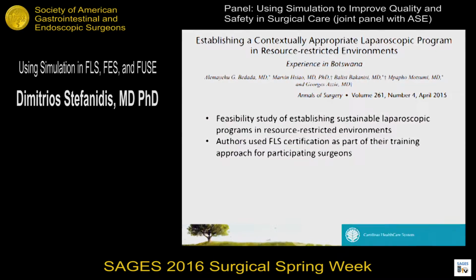Finally, this article was published last year, but it demonstrates a different perspective of how you can use FLS to improve training and the implementation of a new procedure in your practice. This is best studied in underdeveloped countries, because the way we evolved FLS came after the introduction of the new technology. In this particular experience in Botswana, there was a hospital that wanted to introduce laparoscopy.